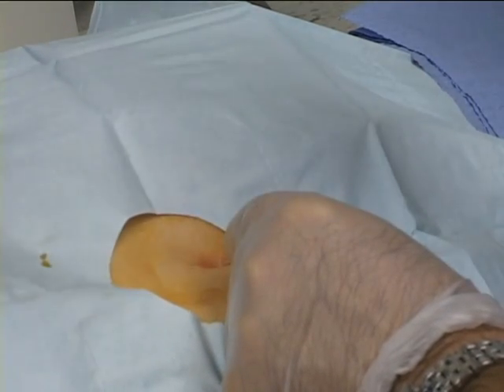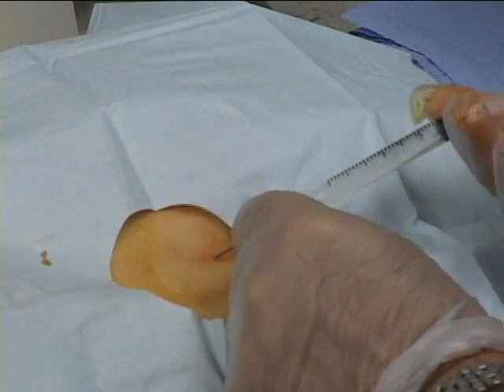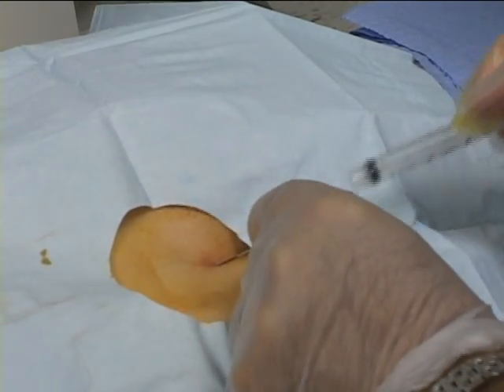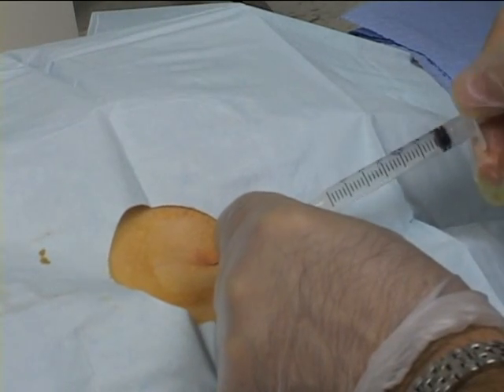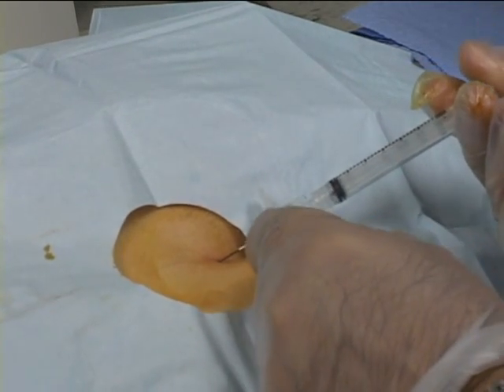The Depo-Medrol is quite a small dosage, which does the job without causing side effects. For example, like today we use here, this is a needle, we use here the needle and injected the Depo-Medrol.